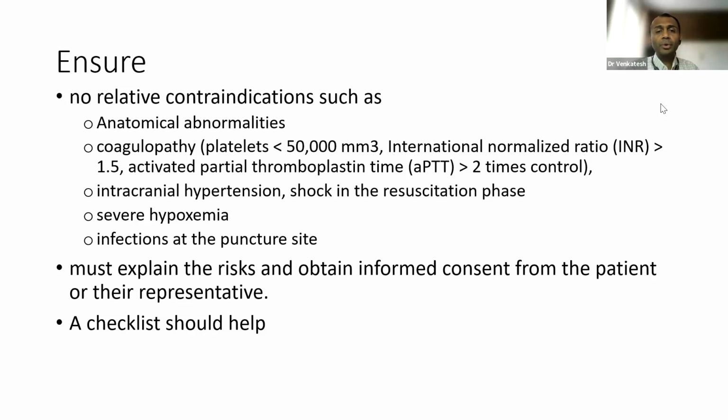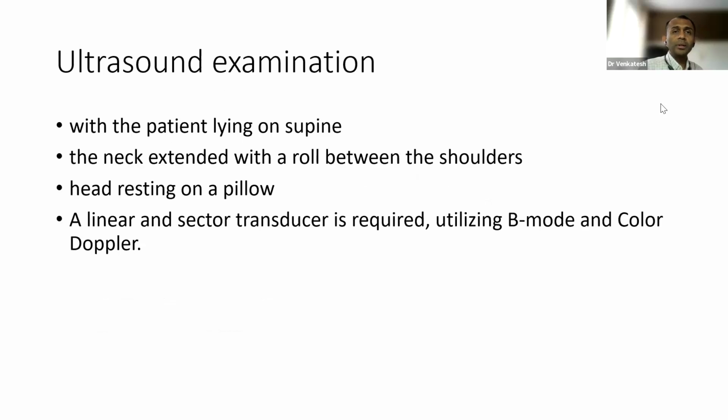We should explain the risks and obtain informed consent. These are all mandatory steps. Having a checklist always helps so that you don't struggle in the heat of the moment where something is missing. So we always position the patient first. Preliminary examination will be conducted with ultrasound. Before that, you may have to sedate and paralyze the patient, with adequate sedation and paralysis.